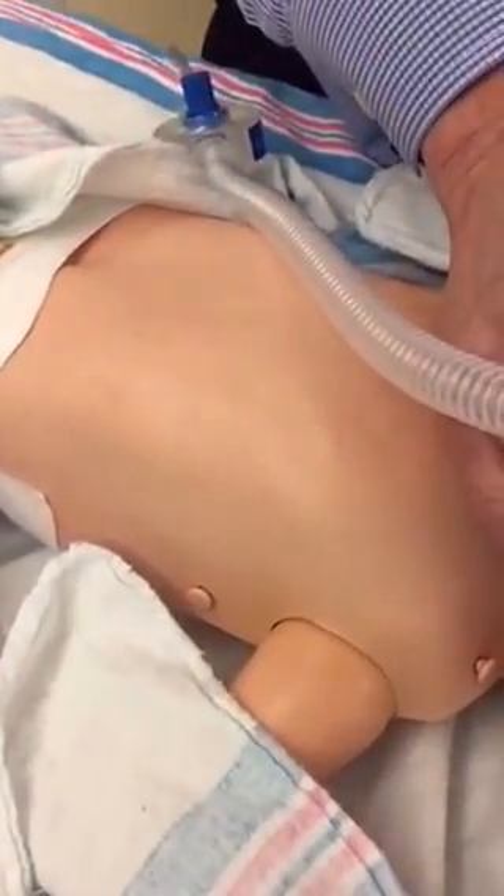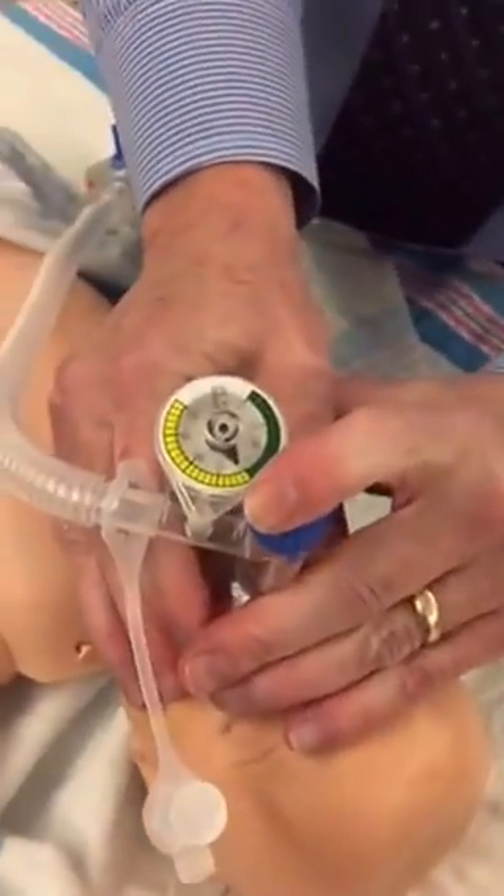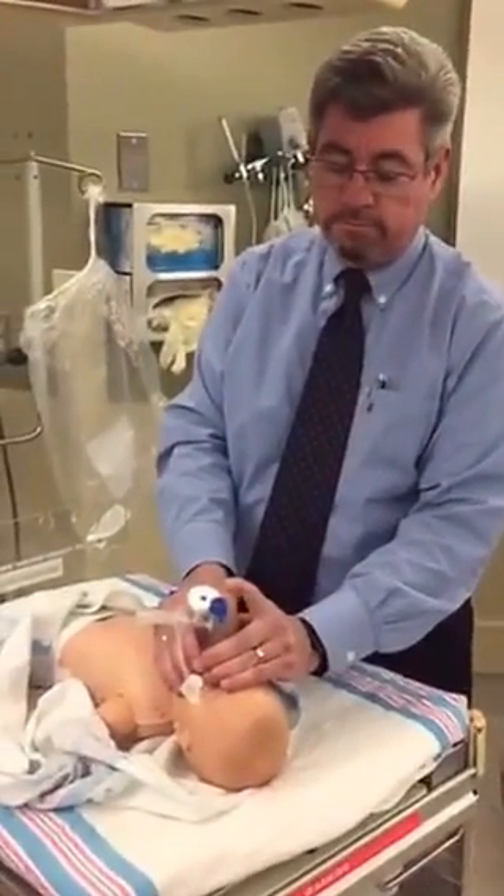The great benefit of T-piece resuscitation is that it doesn't make a difference who's actually doing resuscitation. The baby feels exactly the same thing because what we really have done is created almost a manual ventilator where everything is preset and we know exactly what's being delivered. That's all there is.